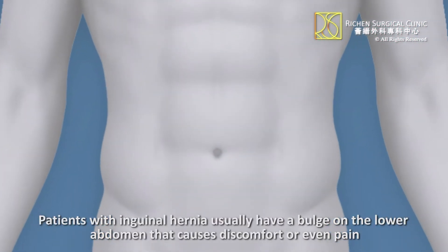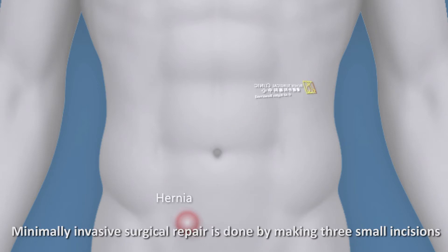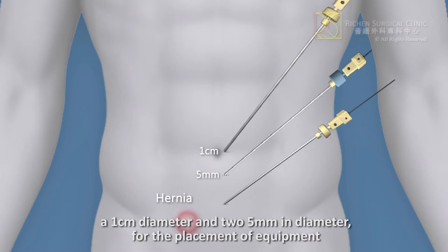Patients with inguinal hernia usually have a bulge on the lower abdomen that causes discomfort or even pain. Minimally invasive surgical repair is done by making three small incisions — a 1cm diameter and two 5mm in diameter — for the placement of equipment.